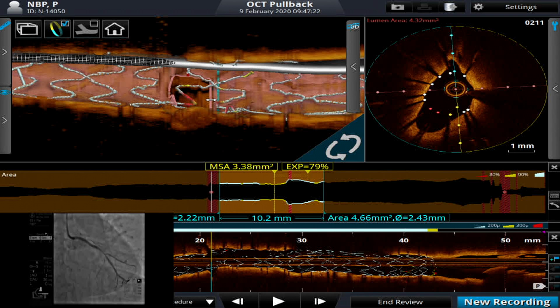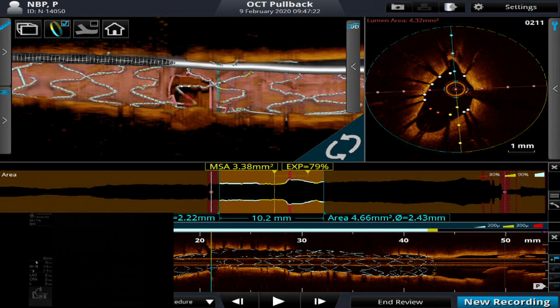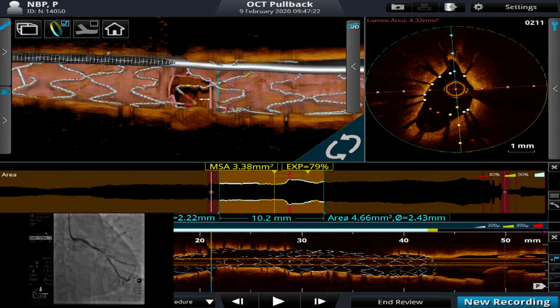While they are preparing, I will try to show the OCT of the previous bifurcation lesion. Yeah, here is the big diagonal. Can you see the OCT image? Yes, we can, and we are looking forward to you telling us how predictable it is to cross distally versus proximally in what you're showing us.